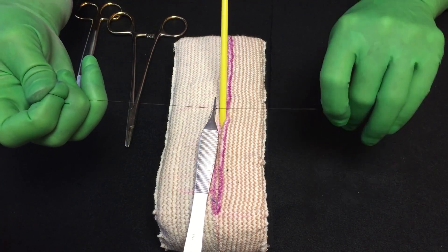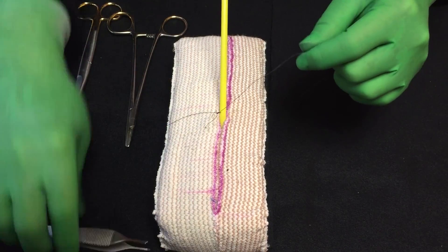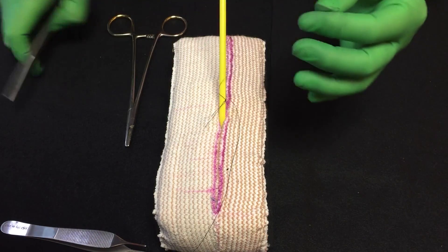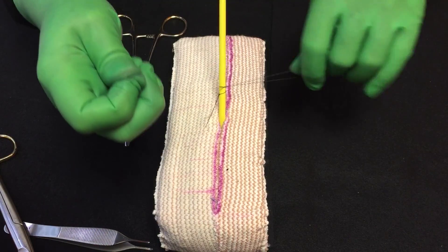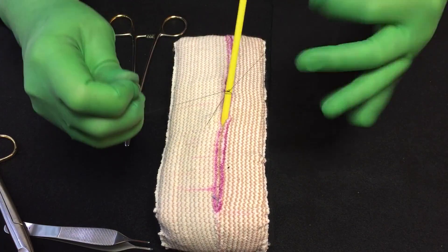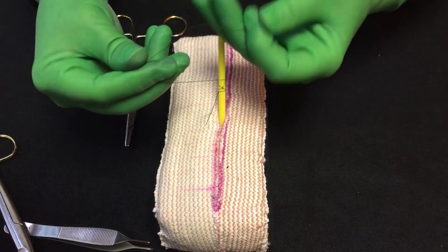Sometimes the forceps falls out and that's okay. Once the loop is secured, you don't have to worry about it. So I've got the loop now. I can take this out and then I'm going to go around the drain. This is a little bit longer than I want, so I'm going to cut off a little bit. Go around the drain. You want to tie it tight enough that it's snug so the drain won't slip, but not so tight that it occludes it. So you want to make sure you get it firmly around there. And just to make sure I don't get slippage, I will usually go around twice and tie the drain.